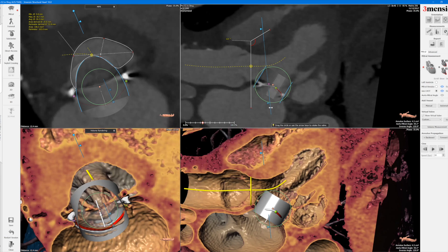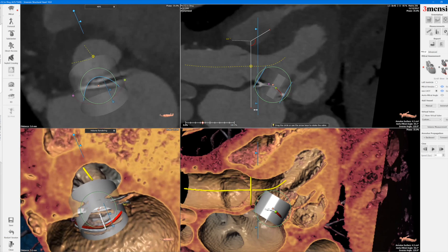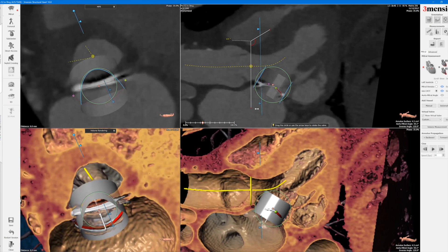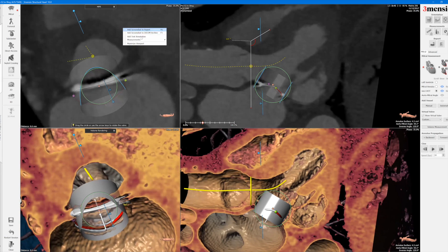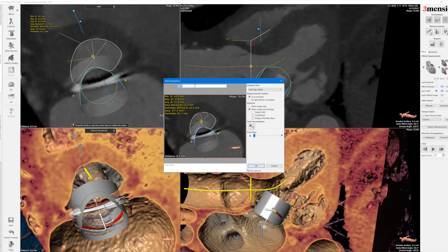Don't be fooled — this is the narrowest portion at that level, but if you go higher up, the neo LVOT might actually be smaller in between the native aortic annulus and the narrowest part of the outflow tract. Right-click and delete this — as you go higher up the cavity space will shrink. Sometimes the new neo LVOT might actually be smaller further into the outflow track towards the annulus. You can certainly do more than one neo LVOT calculation to be very conservative.